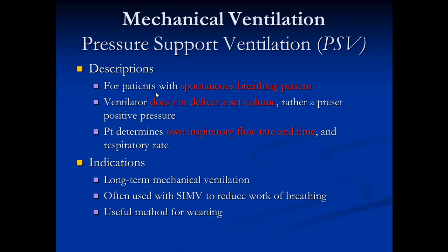Pressure support may also be coupled with SIMV, as I said, primarily as a means to diminish work of breathing. The amount of pressure support set during mechanical ventilation is titrated according to the tidal volume. And I will explain in class how to choose your best pressure support.